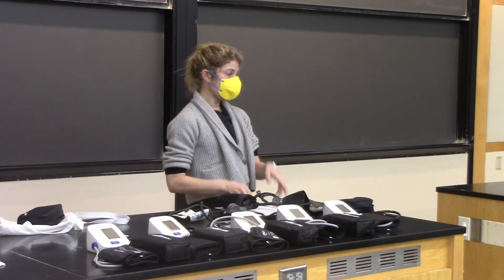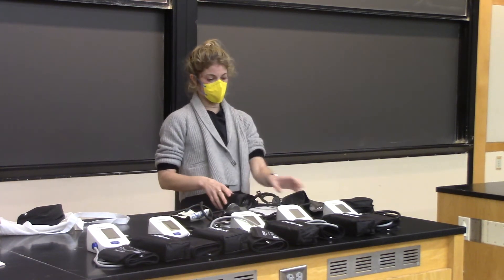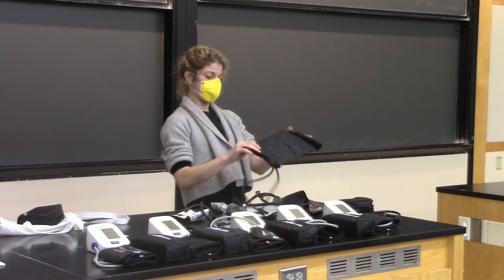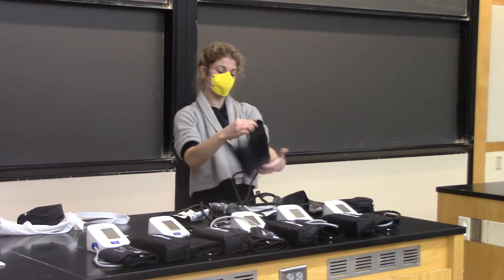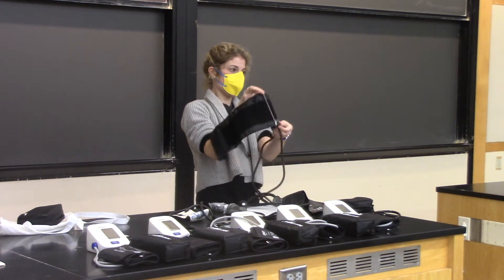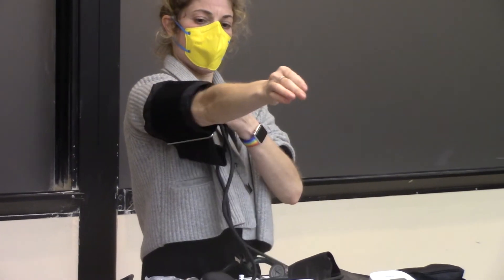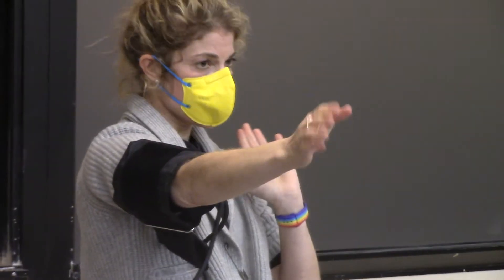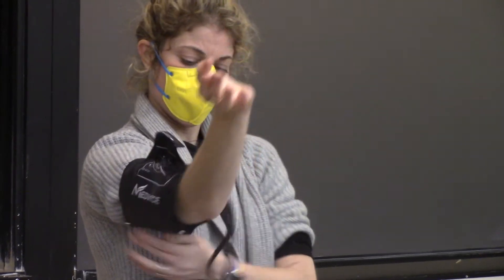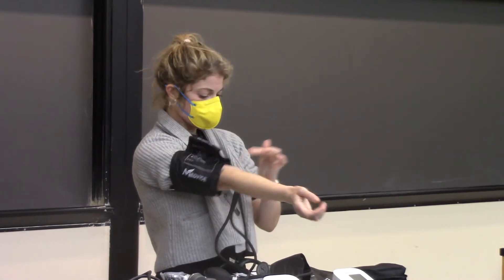The first thing you have to do when taking blood pressure is locate the brachial artery. The second thing is to place your blood pressure cuff. You'll see it has a little cheat sheet and it says 'artery,' pointing downwards. Put the cuff on the person's arm — not over a heavy sweater, a thin layer is fine — and make sure the artery marker is pointed down, above the antecubital fossa.